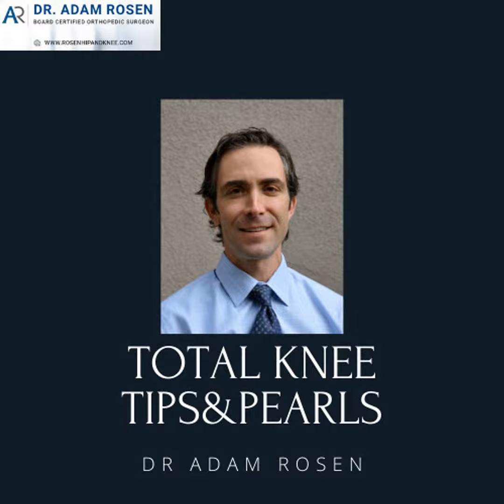Now, at this point, you've had your femur off, you've had your tibia off, and now you're exposing the bone. I don't typically spend a lot of time at this point picking out all the cement. I see a lot of people at this point, your eye fixates on this cement, and a lot of people spend a lot of time picking out all these little pieces of cement everywhere. The reason I don't do that now is because you're going to make a freshening cut. You're going to make a cut on your distal femur. You're going to make a cut on your tibia when the time comes, and you're going to remove all that stuff. So once you make the freshening cut, if there is cement left over, then I will remove it.